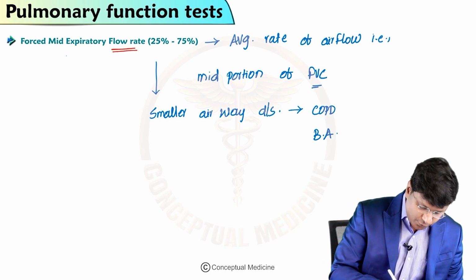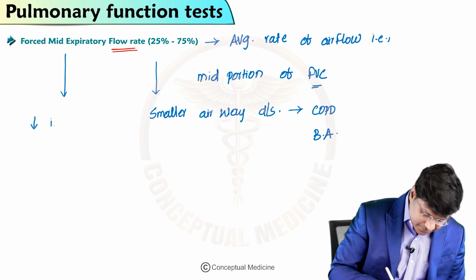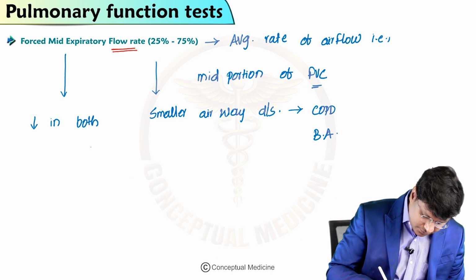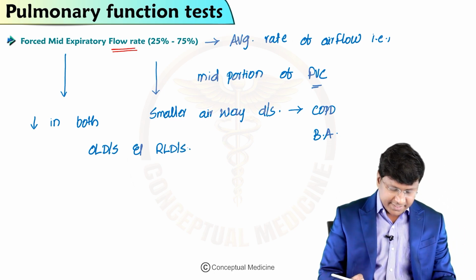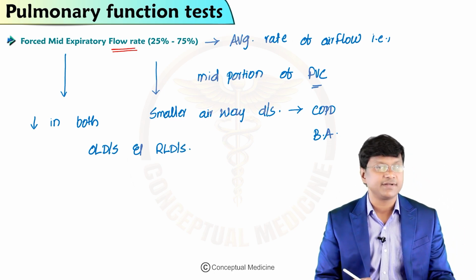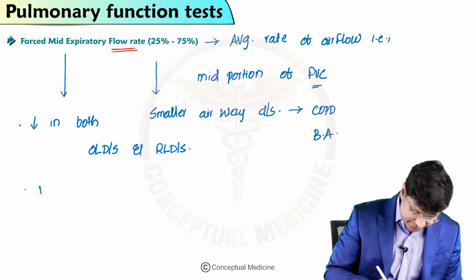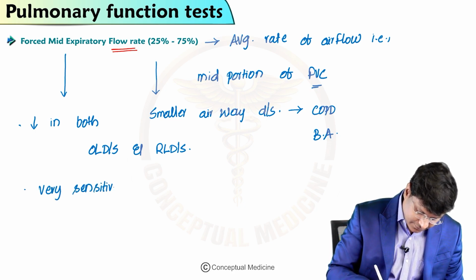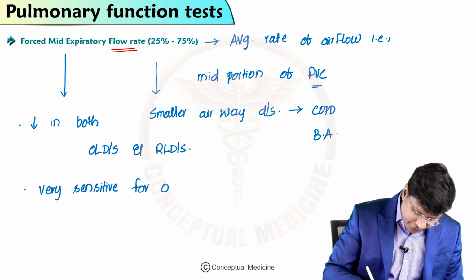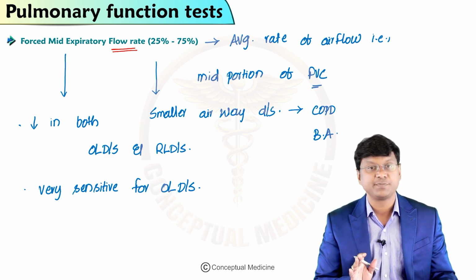Okay. Now, this forced mid expiratory flow rate is reduced in both obstructive lung diseases and restrictive lung diseases. Right? But it is very sensitive for obstructive lung diseases. That is about your forced mid expiratory flow rate.